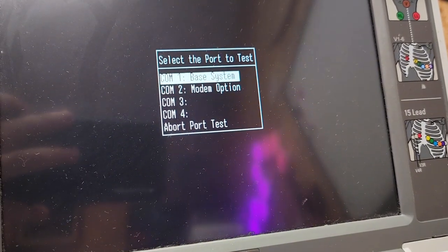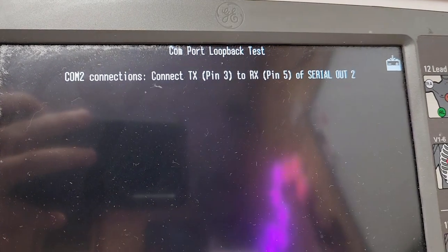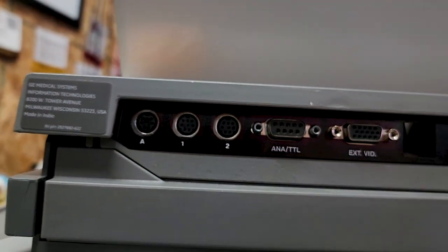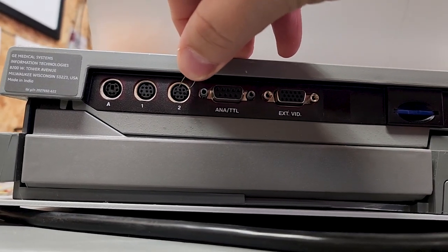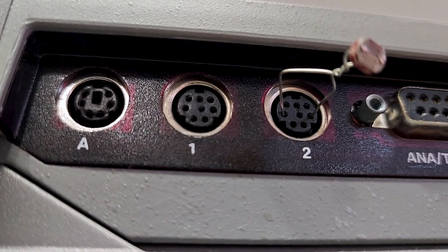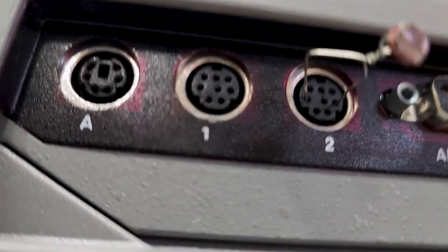I'm going to come over here to 'COM Port Loopback' and let's test the modem port. It tells you: COM 2 connections — connect TX pin 3 to pin 5 of Serial Out 2. So on COM port 2 we're bridging pin 3 and pin 5. If you can see what I'm doing, I'm connecting the two edge pins of the middle row and shorting them out — that's it.